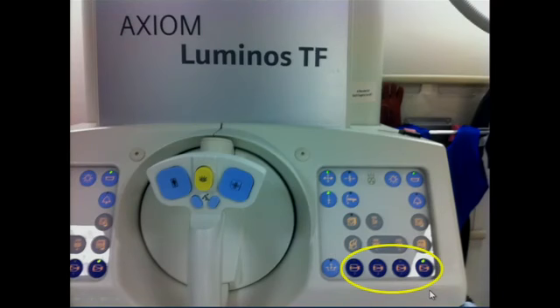And here are these magnification modes. And I tell you, really use them sparingly, especially on old II systems. Because on old II systems, if you magnify down to a smaller region, your minification gain is reduced, right? You now have a smaller area being projected onto the II. So there's not as much minification gain. And therefore, the amount of mA is boosted by the automatic exposure control to keep the brightness of the image about the same. That isn't quite as bad an effect in digital imaging systems where you can digitally boost the brightness of the image instead of having to do that. But you do pay the price of the image being a bit noisier there.